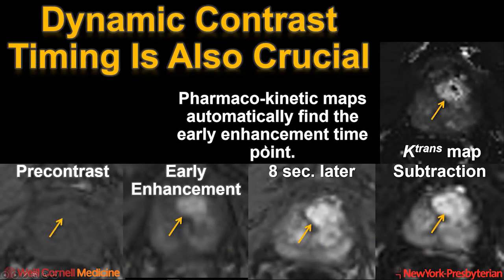Similarly, dynamic contrast timing is crucial. Here is a pre-contrast image of the prostate where you can see that it's uniformly T1 hypointense. At the early enhancement time point, you can see that there is focal early enhancement. But eight seconds later, this is nearly entirely obscured, even on a subtraction map. Of note, the K-trans map, the pharmacokinetic map of wash-in, also identifies this area as early enhancement, which can be very useful.